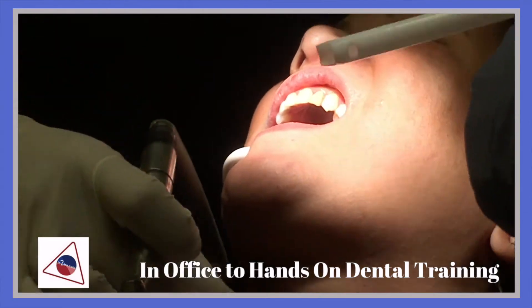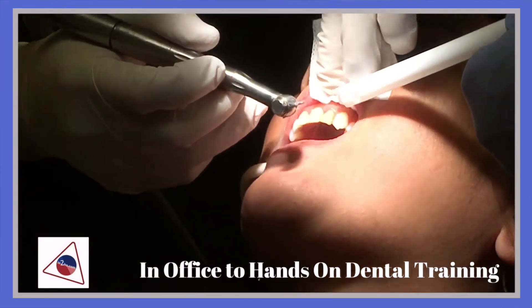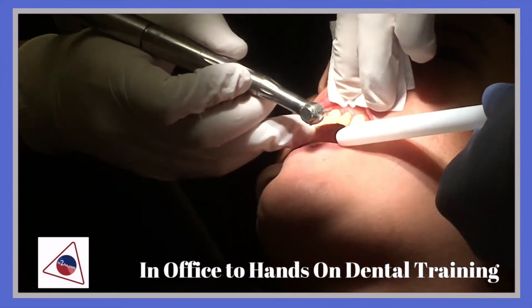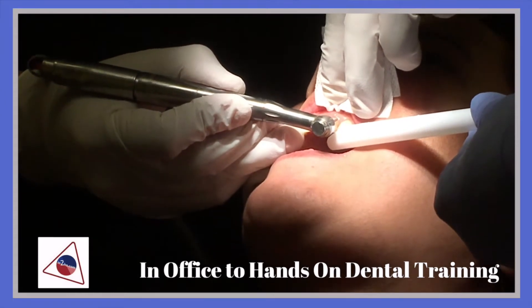Now, if you don't catch it with the suction tip, the water will go all over the place. I could go right on the buccal, on the cervical area.